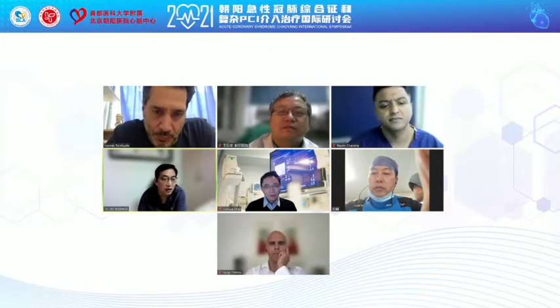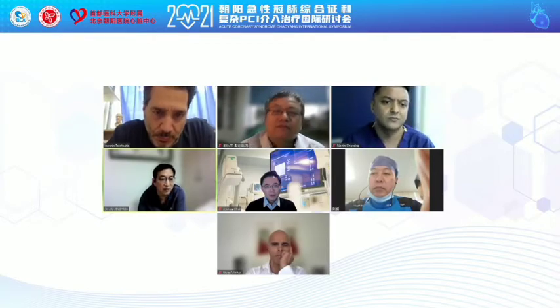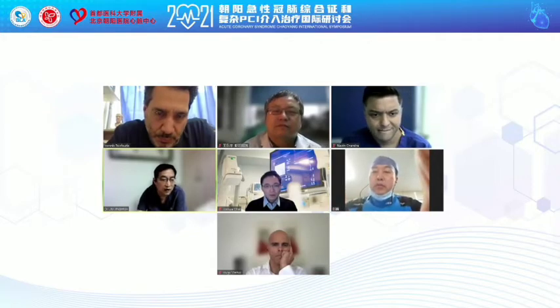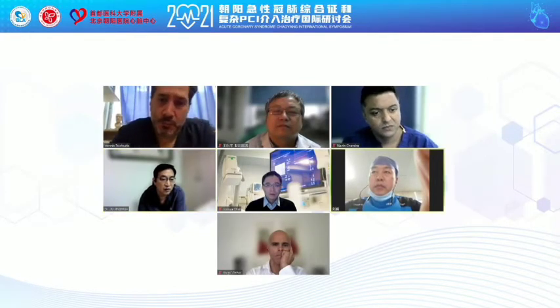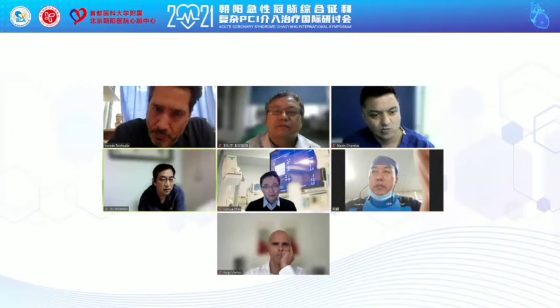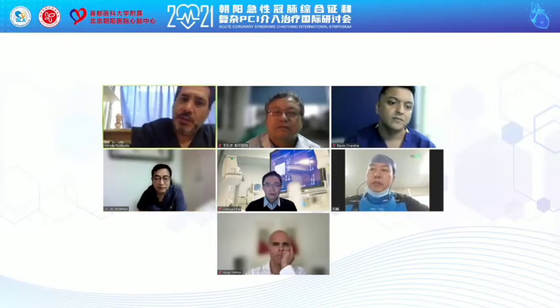But if we have the tiny balloon, we can use the tiny profile balloon to cross the lesion very easily. So finally, we can see the excellent result. Thank you. I agree. Thank you for this.